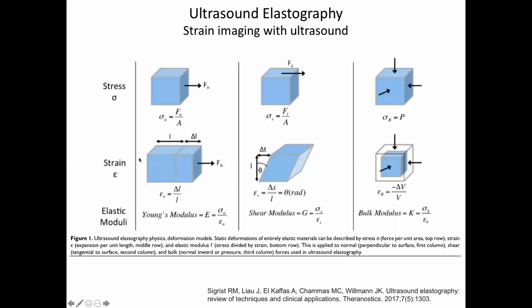These are the modes. This is basically longitudinal strain in 1D, and the Young's modulus is the ratio of the stress required to produce that amount of strain, right? In that direction. So how much force do I need to apply to this face in order to stretch this thing out by that much?